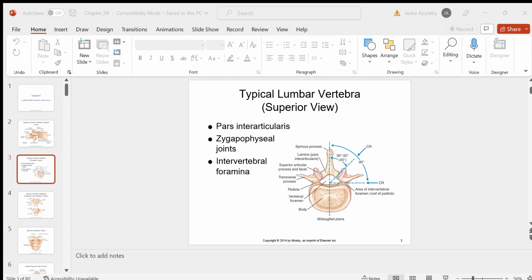Practice is good, reading the books is good, but it's going to come down to manipulating this stuff, having it in your hands like that. Anyways, that's the thing: a 45-degree angle shows us our zygapophyseal joints. That means zygapophyseal joints are shown when we oblique the patient.